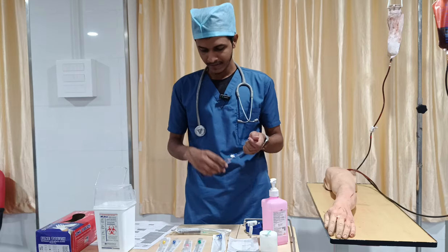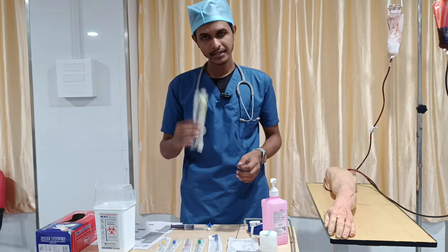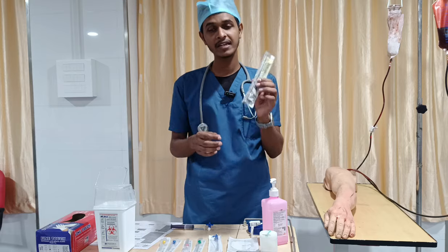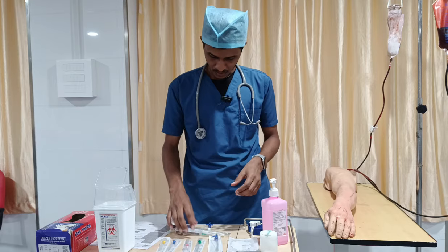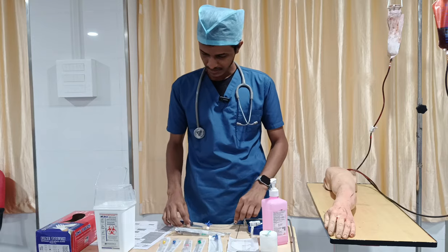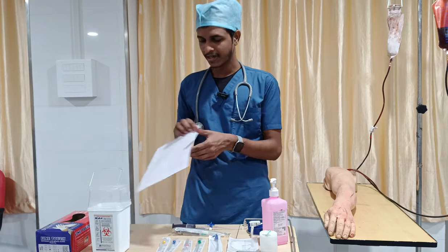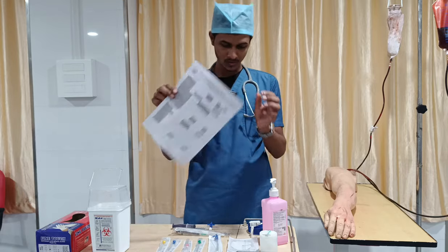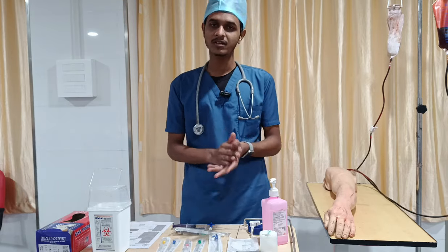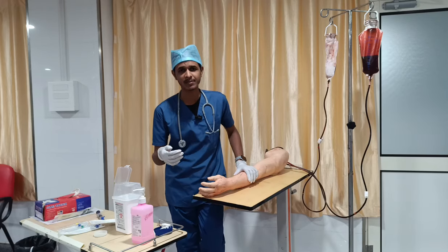And then here I have a 10 centimeter extension, and here I have a 10 cc syringe to see the flashback and to verify the IV cannulation. You can take it separately, and you can pre-fill it like this. So a pre-filled syringe you can take, and then here I have a puncture-proof container, and finally I have a documentation paper. So these are the equipment you have to arrange on your hand side before doing the procedure. So let's get into the procedural part.